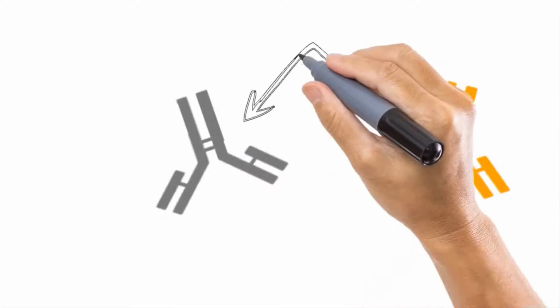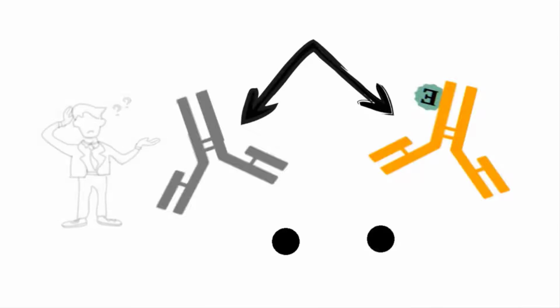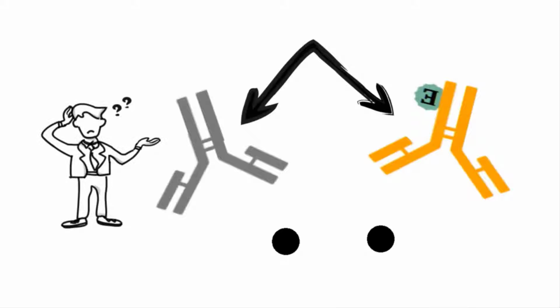These two types of antibodies will compete with each other to bind the antigen present in the well. Now you might think, which type of antibody is going to win this competition? Well, the antibody with the greater concentration wins the competition. Now we don't know which kind of antibody's concentration is more. Let us assume both the situations.